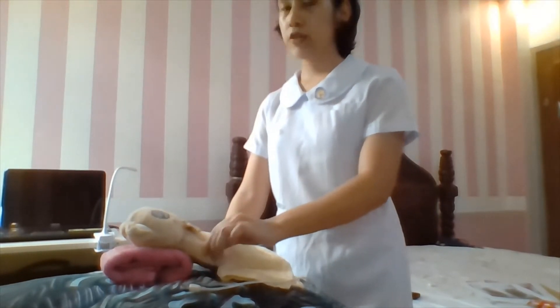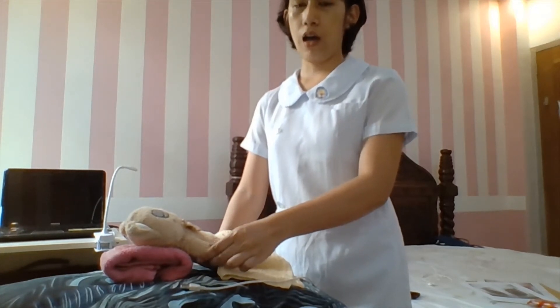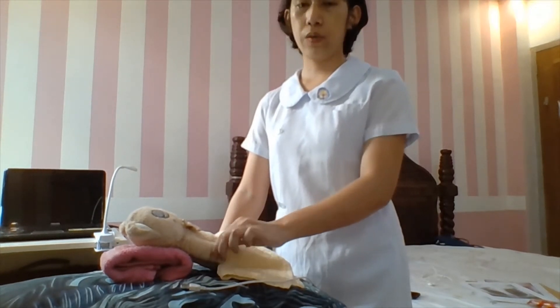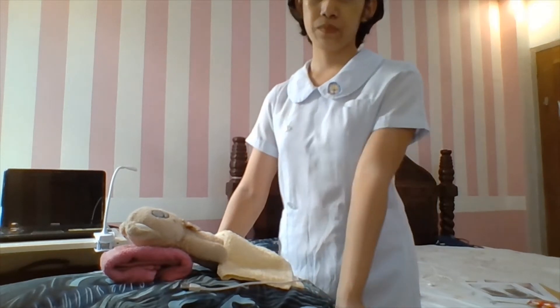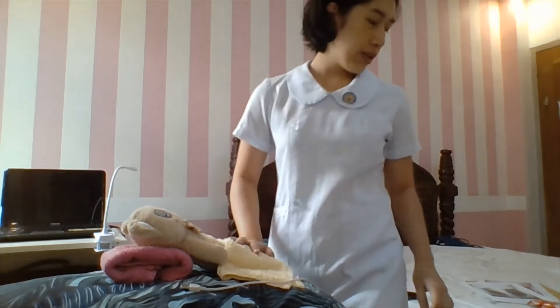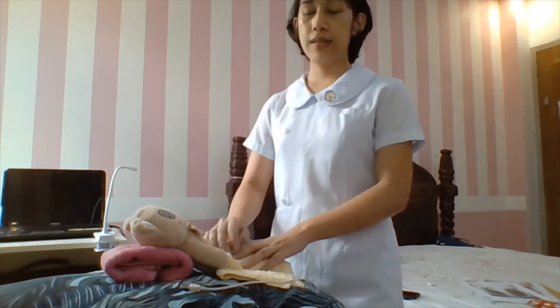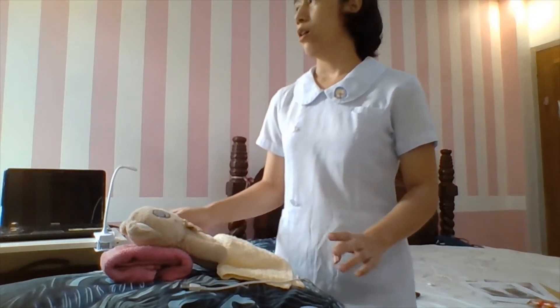Select flat and fleshy positions to place the electrodes, avoiding muscular areas. If the patient is hairy, do not shave the hair — instead, clip it.